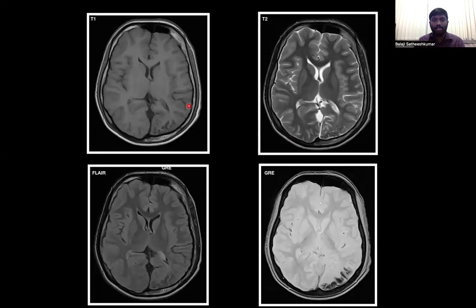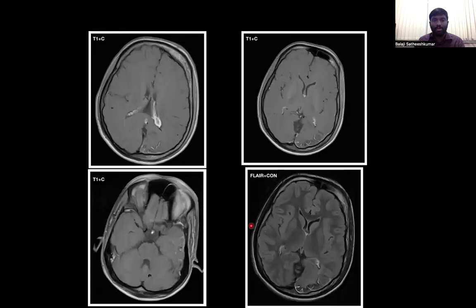In the next case, we see left-sided hemiatrophy along with T1 and T2 FLAIR hypointense signal along the left parieto-occipital lobes, which shows blooming on GRE suggestive of calcification. On post-contrast study, we see pial enhancement along the cortical sulci and gyri of the left parieto-occipital lobe with thickened and enhancing choroid plexus, suggestive of Sturge-Weber syndrome with calcification.